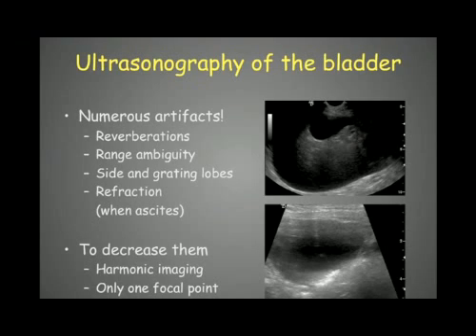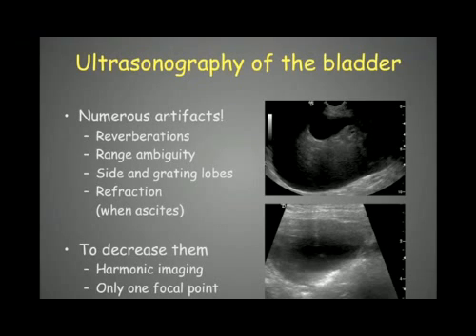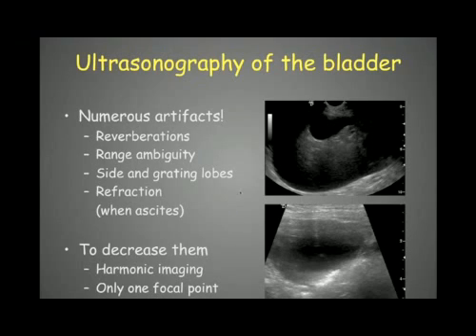We can also have refraction artifacts when there is ascites. When you have ascites or fluid around the bladder plus fluid in the bladder, we can have some refraction that creates a false interruption of the bladder wall. We should not think this is an interruption due to a rupture — it's just an artifact due to refraction.